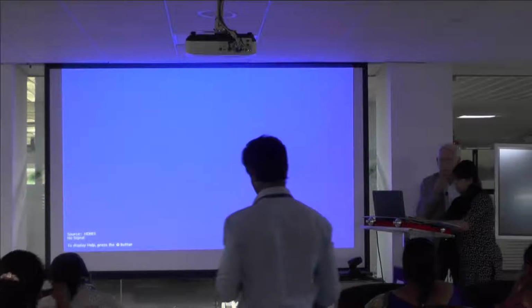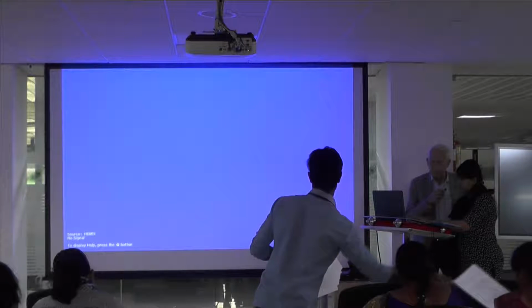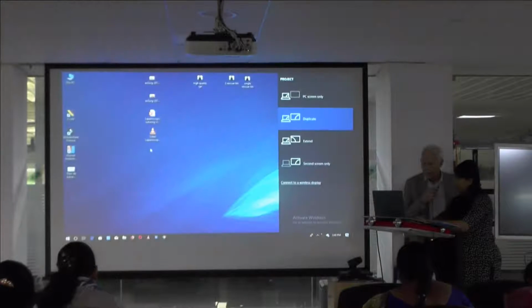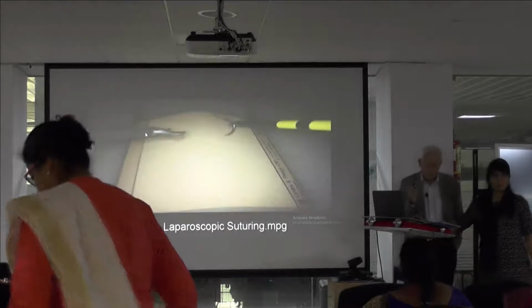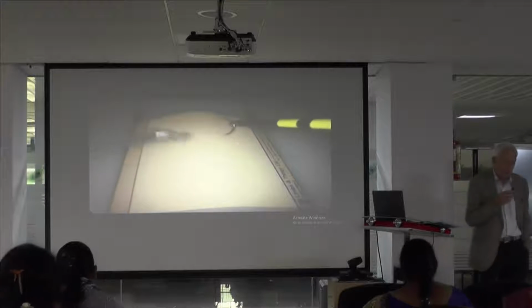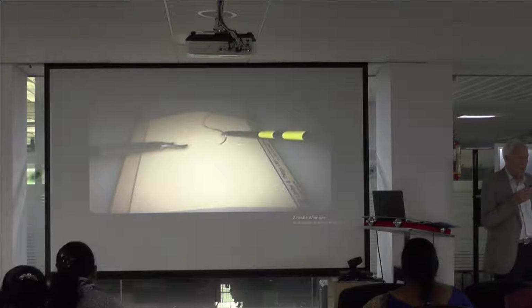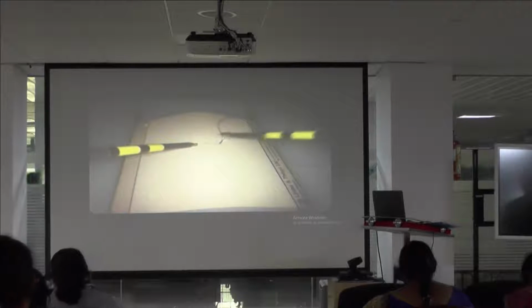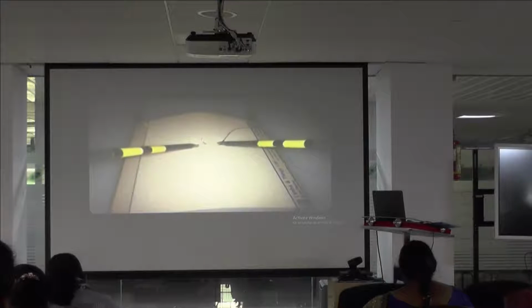And if you look at the forms, then you'll see that it is important to look very critically at how the people handle the needle, if there are needle drops, if there are errors, if both hands are used, so if the process is bimanual.